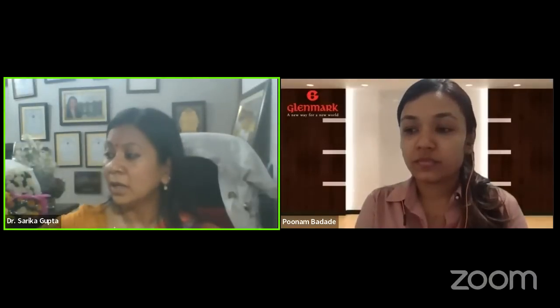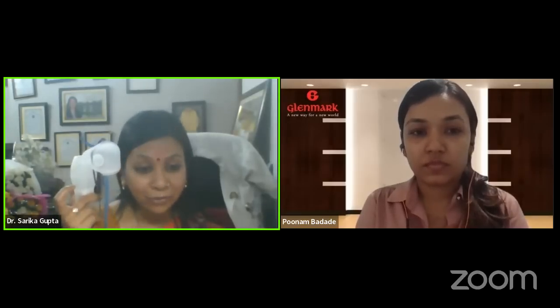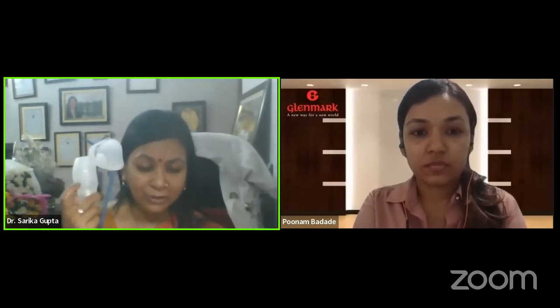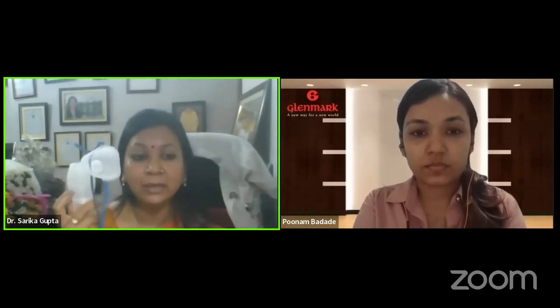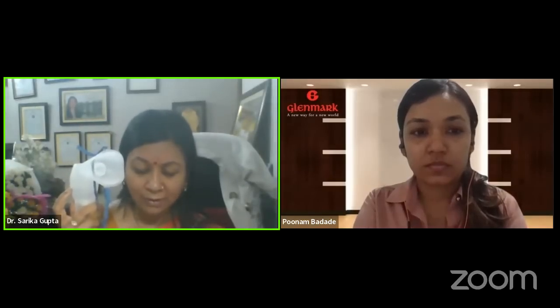No. As I told in this presentation, nebulization, especially with this jet nebulizer that you are using, should be kept in an upright position. So nebulization should not be given in the lying down position. If the child is slipping or you feel the child is not comfortable when sitting, ask the mother to take the child in her lap. So it should always be in the standing or sitting position.